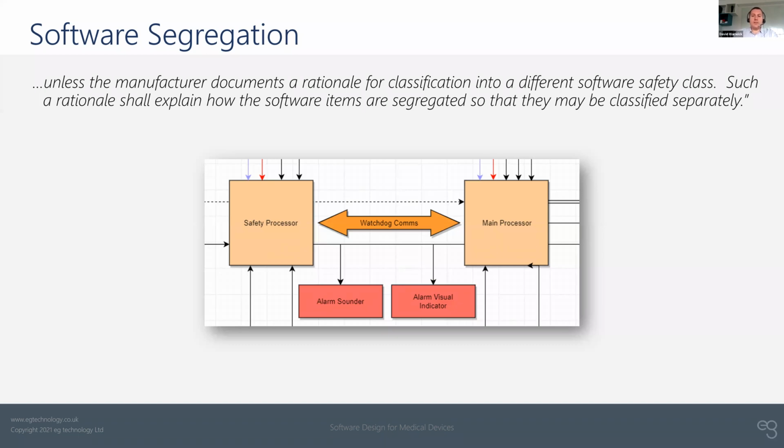But in many systems, the determination of an error requires a more complex measurement than something like a single point value and a cutout based on being either side of those values. It might be that you need to measure a number of parameters simultaneously, and some combination of those needs to be determined for safety. In that case, you can segregate the design similar to what I've put on the screen here, by thinking about an architecture which moves the key functional safety elements into a separate subsystem from what operates all of the main functions of the device.